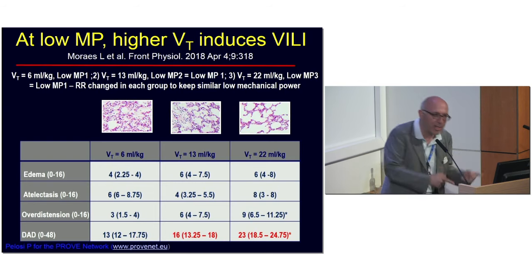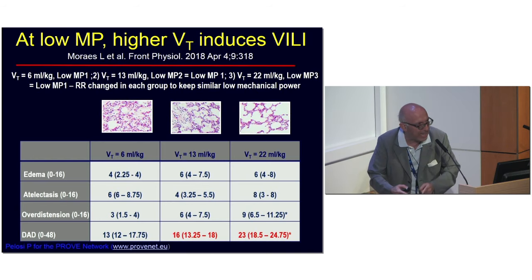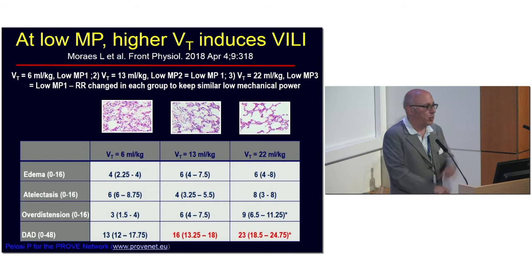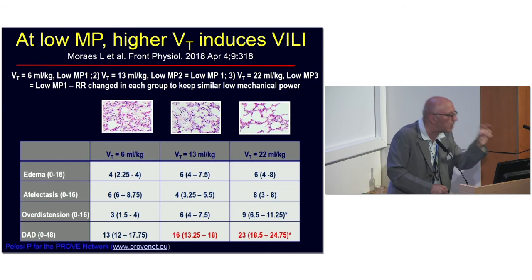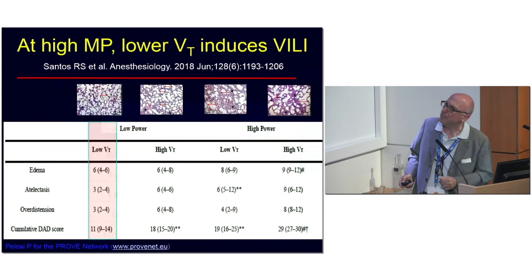If you deliver the lowest mechanical power with a higher driving pressure or higher tidal volume, you don't get the positive effects. So again, the lowest tidal volume, the lowest driving pressure and the lowest plateau pressure are the best combination in our condition.